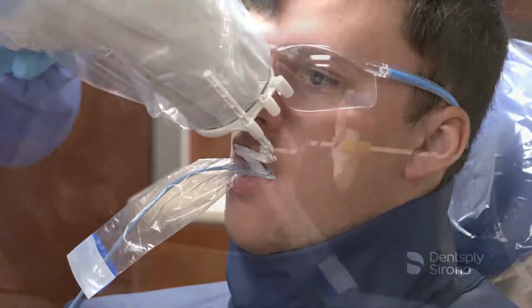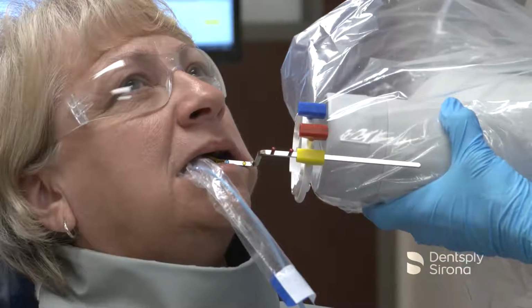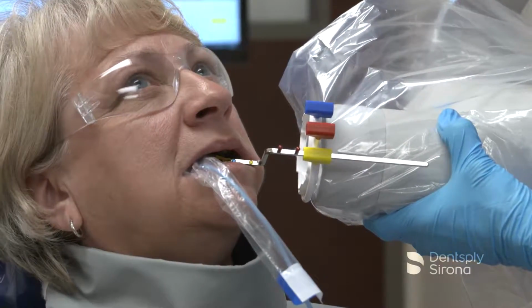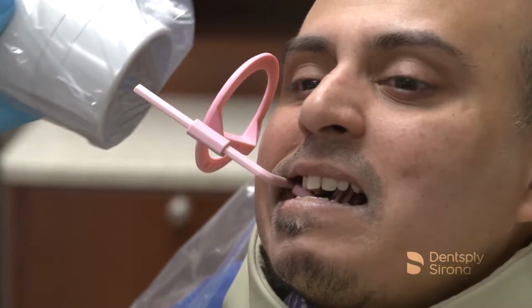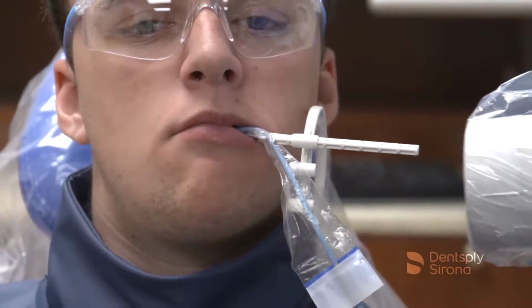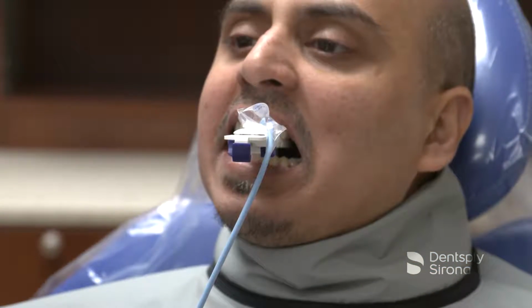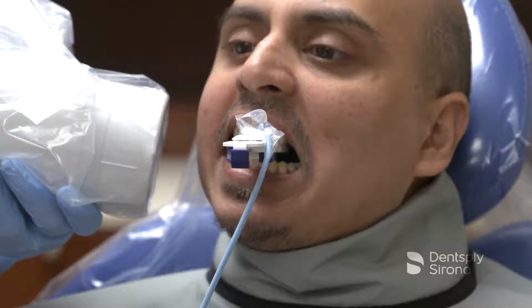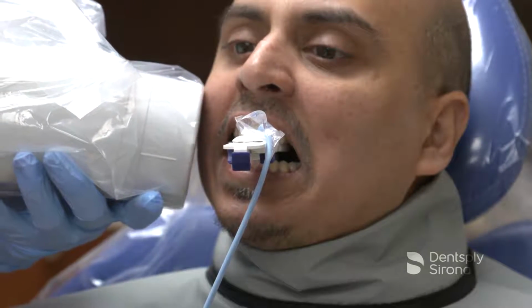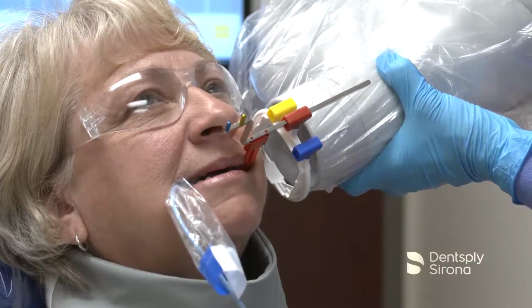Dental radiographs are valued diagnostic tools when the image quality is adequate enough for proper interpretation. To do this, it is imperative to correctly place the image receptor in the mouth and ensure that the primary X-ray beam is centered and aligned correctly in both the vertical and horizontal angulations. At this time, it is crucial to minimize patient exposure to radiation. Successful images require the use of careful technique and precautions to maximize their diagnostic and interpretive value.